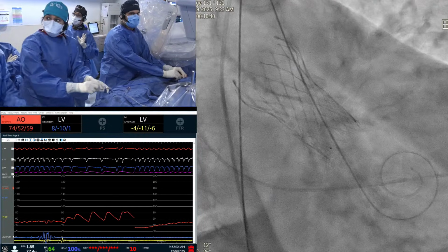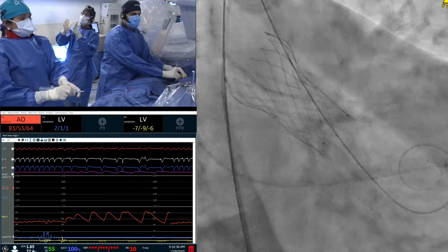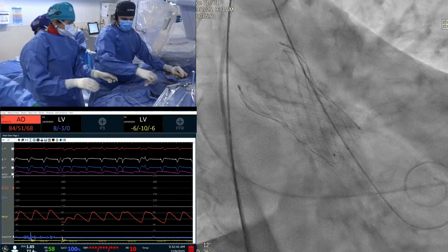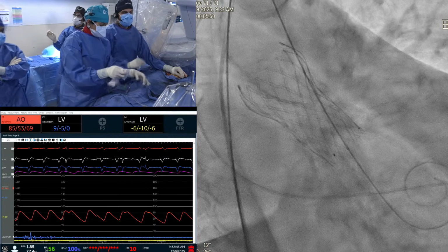What we were saying is that at the cusp overlap, when you start to flower and expose the capsule, you can do it quickly. You don't need fluoroscopy, you don't need an angiogram for that. You can save some contrast.